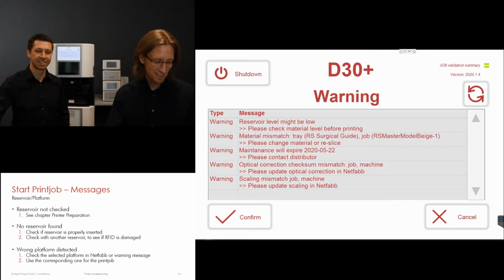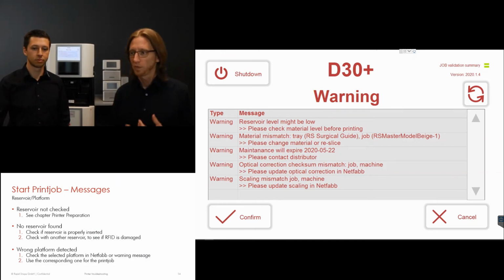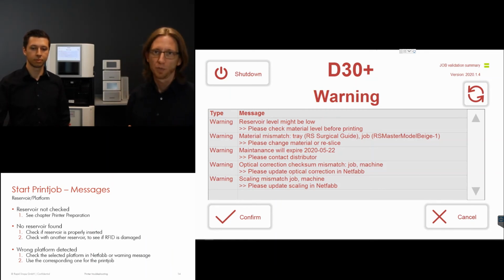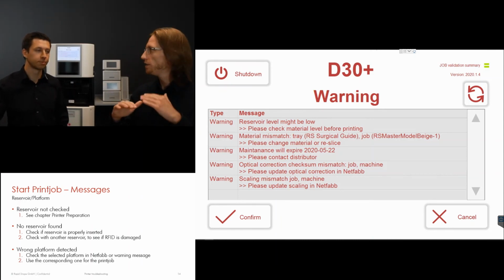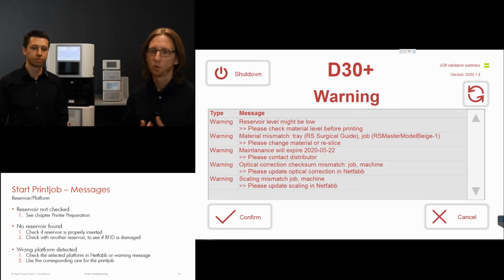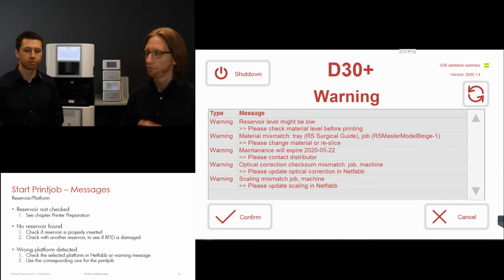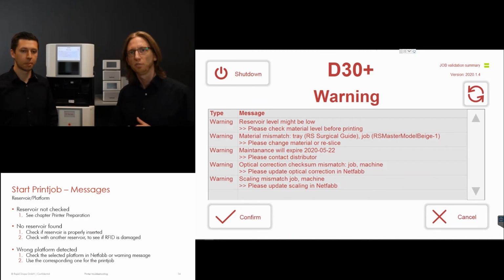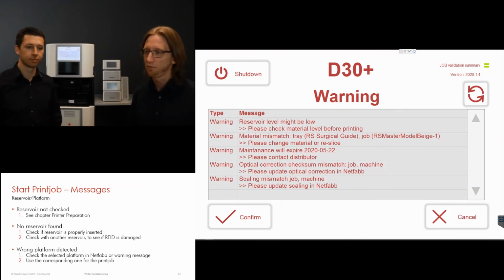We are right here. Okay, so this is all about reservoir not checked. I think we did this already in the first chapter, but just to make clear what we got here, the reservoir check is really important, because in previous webinars we discussed it already. The reservoir actually consists of a glass plate, a silicone layer and a Teflon foil, and if there is some damage you could have problems. So please take care that the reservoir is checked from time to time, and when the machine gives you a heads up, a reminder, please definitely do that. So filter the material back into the bottle, check the surface of the Teflon foil, make sure that it is not damaged and it's clean, no fingerprints, no dust, dirt, anything on it, then it should be fine. But you always have to confirm the message of the reservoir.